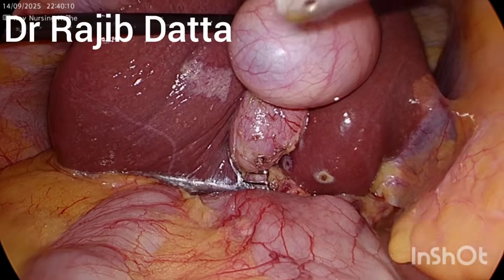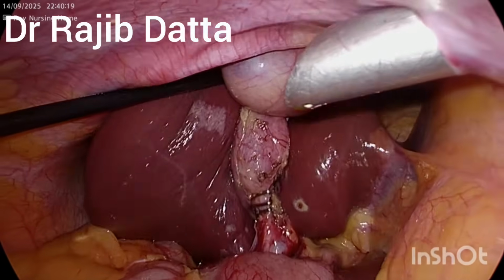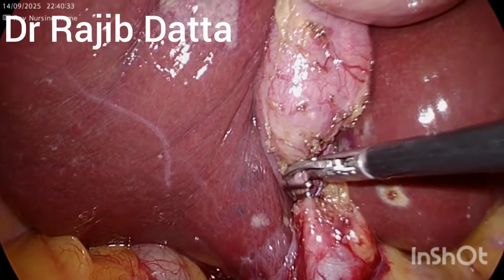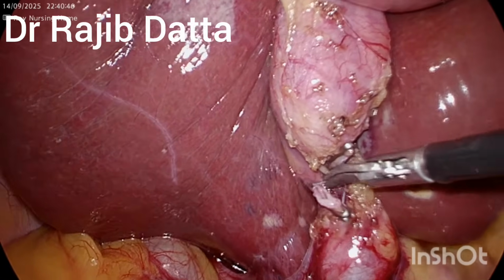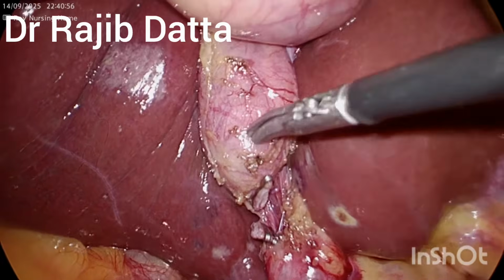Now again the endo scissor has been introduced, and it is now separated. The cystic duct has been cut.